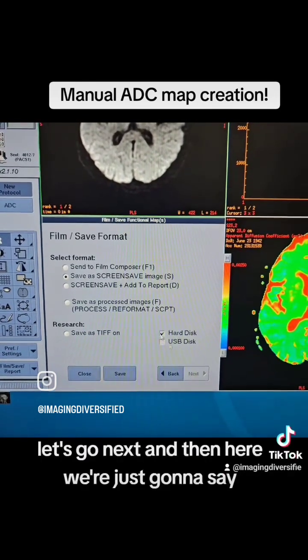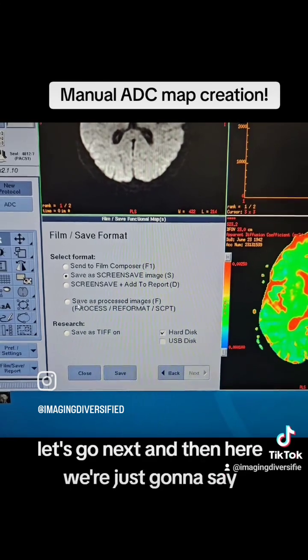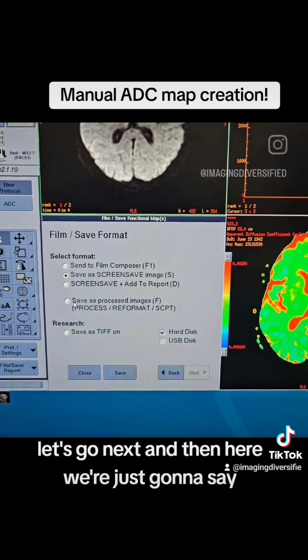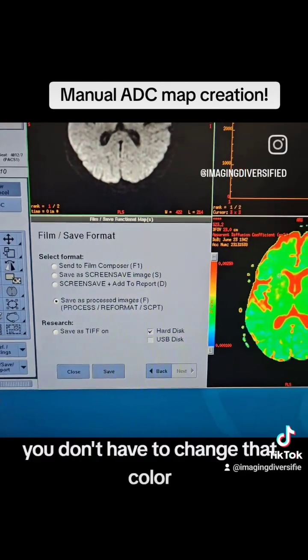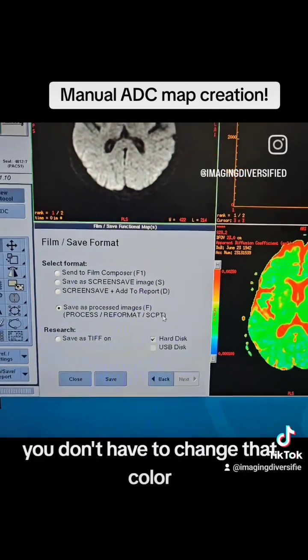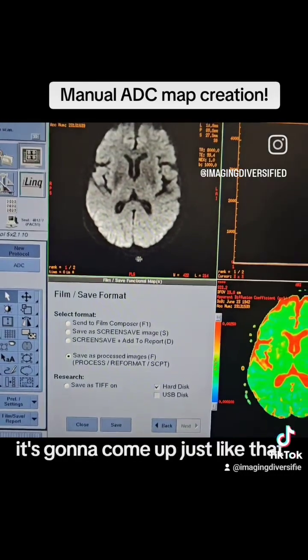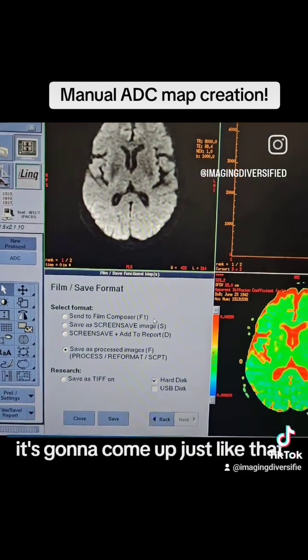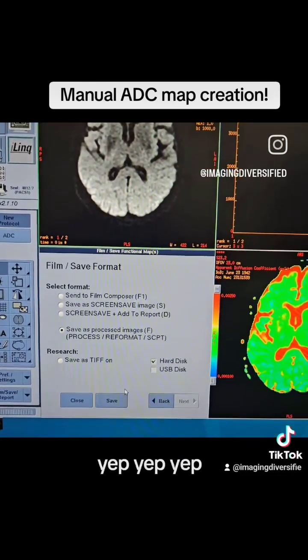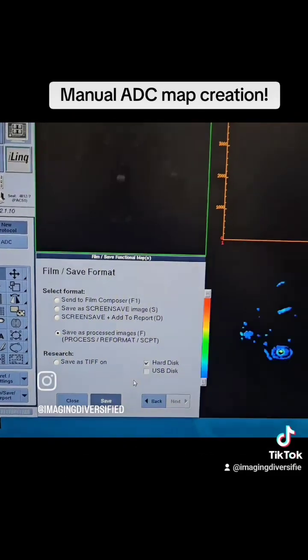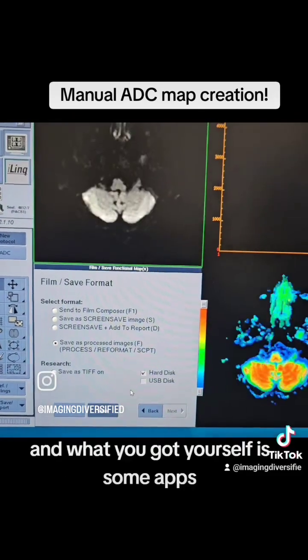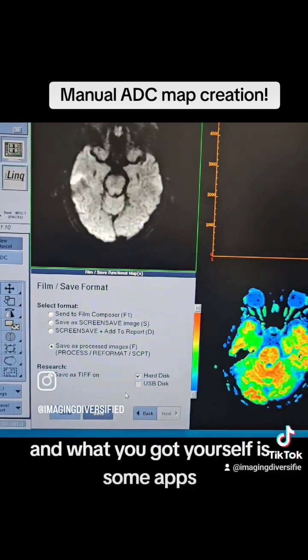Let's go next, and in here we're just going to save. You don't have to change that color — it's going to come up just like that. And all you're going to do is hit save, and what you got yourself are some maps.